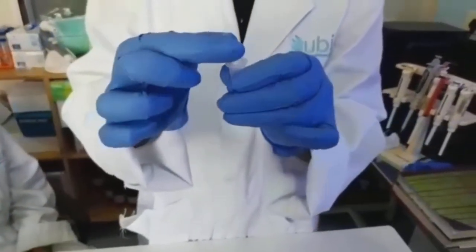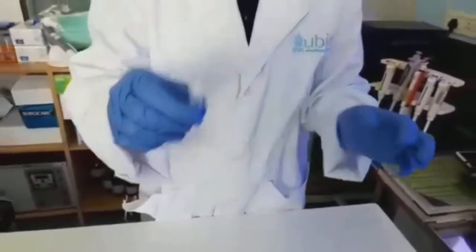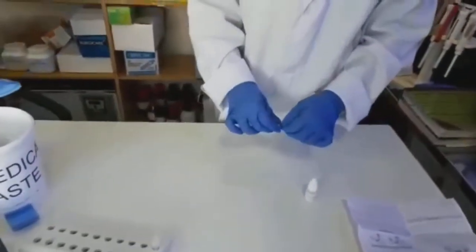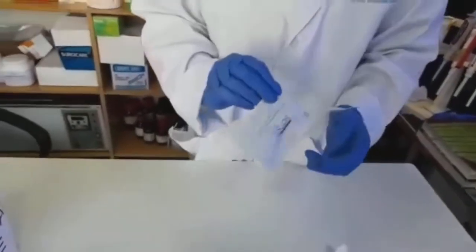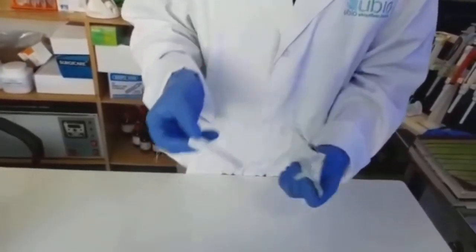Fix the nozzle on the extraction tube. Take out the test card from the foil pouch and place it on a horizontal surface.